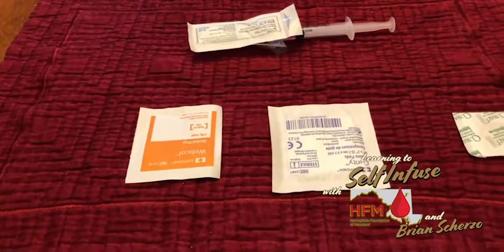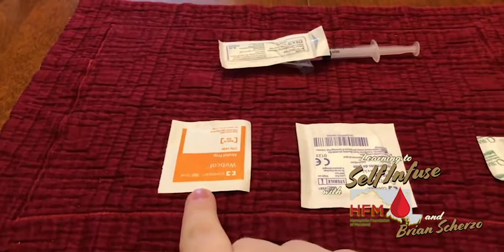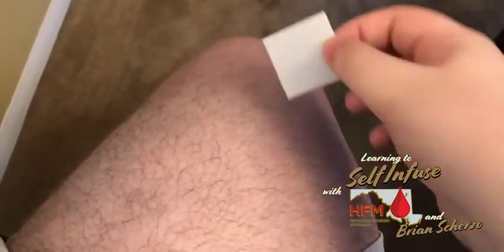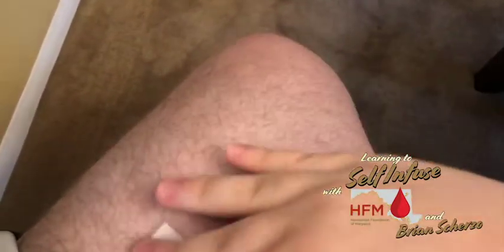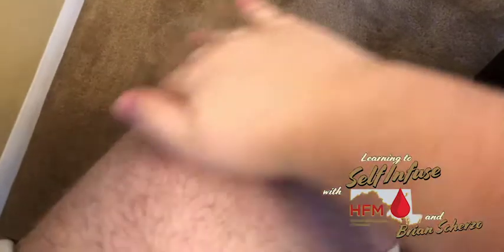Our next step is going to be cleaning off our infusion site with a simple alcohol swab. For Hemlibra, they recommend you cycle your infusion site, so this week I'll be doing it in the top of my left thigh. Just make sure you cover all the surface of the leg to make sure it's nice and clean, then wait a minute or so to let the extra alcohol dry off so it doesn't burn when you do your injection.